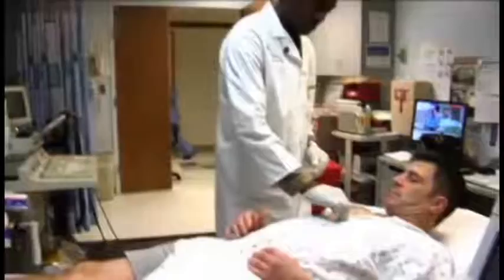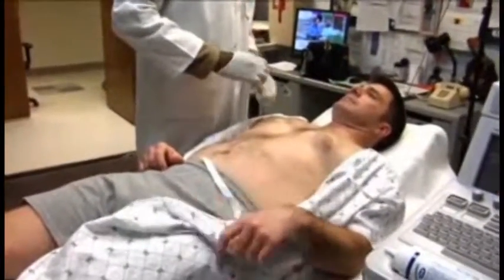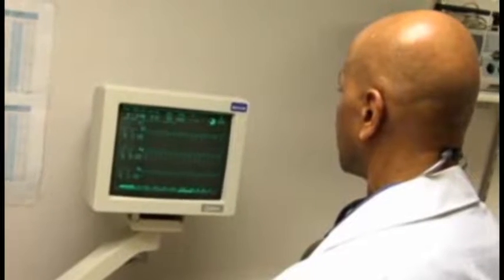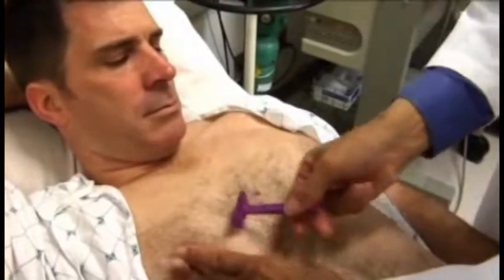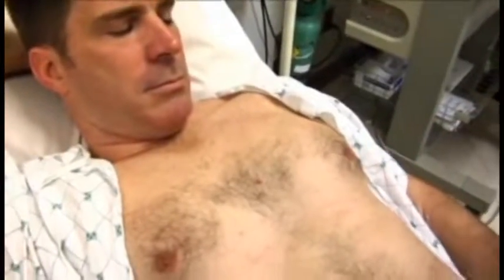You will be asked to disrobe from the waist up and will be provided with a gown to wear. A specially trained nurse will place electrodes on your chest, and wires will be attached to the electrodes so that the electrocardiogram, or ECG, can be monitored continuously during the test. For men, limited shaving of the chest may be required to assure good contact between the skin and the electrodes.